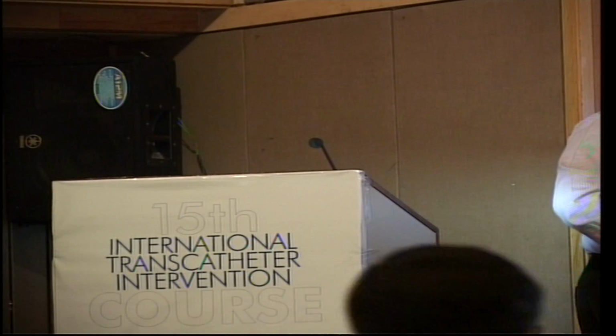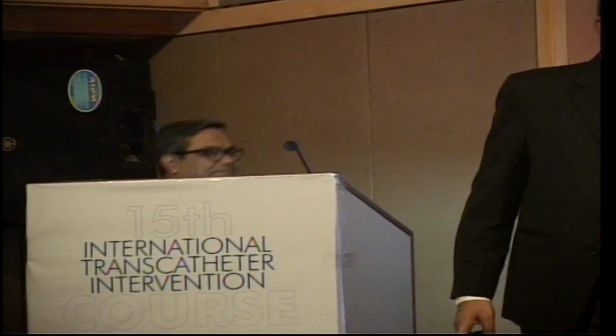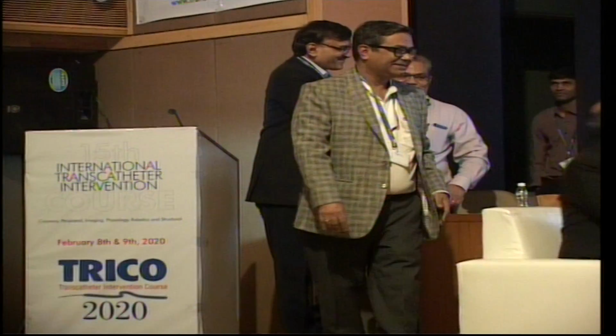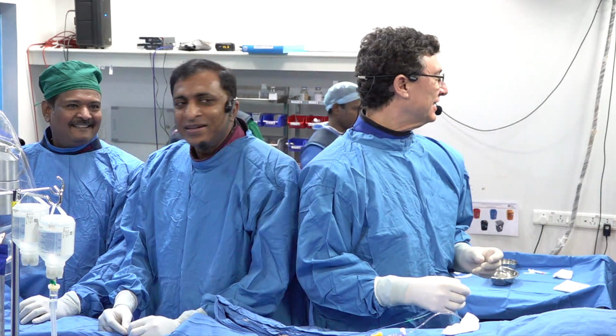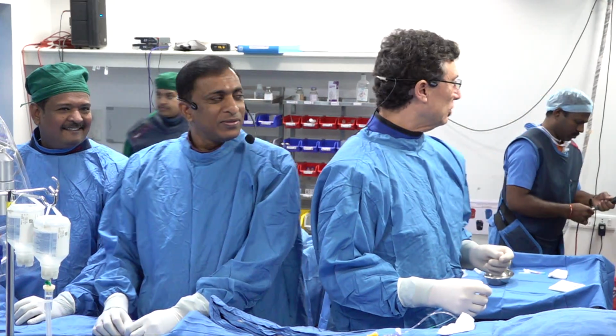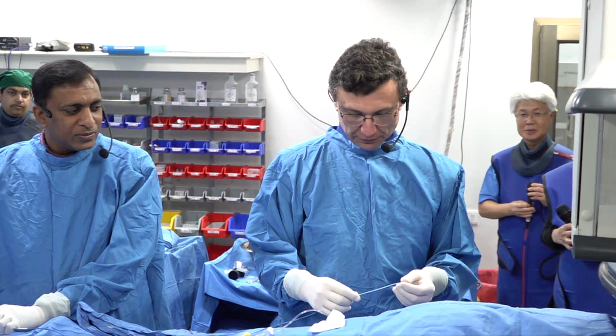Good morning, everybody. I'm here with a terrific team at Apex Heart Institute. We are about to do this two-vessel intervention. My live commentators are Dr. Samir Pancholi, Dr. Fasila Malik from Bangladesh, and then we have Dr. Akasaka Sensei, who's going to help us with, so we have combo technique.